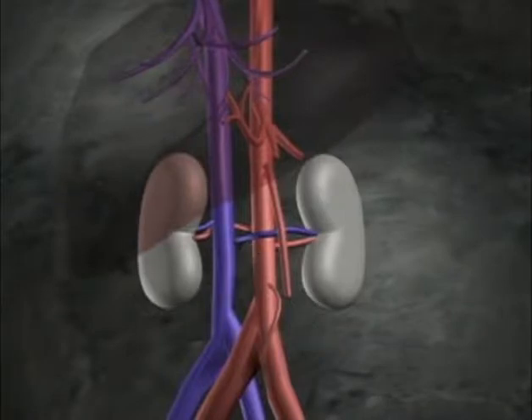As you follow the inferior vena cava to its bifurcation into the common iliac veins, you will note that because the cava is positioned to the right of the aorta, the left common iliac vein will cross under the right common iliac artery. It is thought that the potential for extrinsic compression of the vein by the artery may explain the difference in the frequency of left iliac vein thrombosis compared to thrombosis of the right iliofemoral venous system.